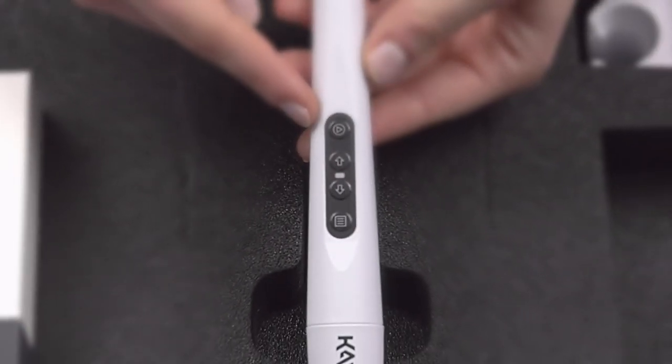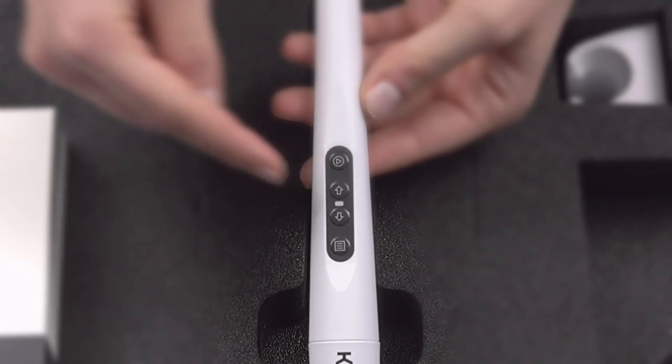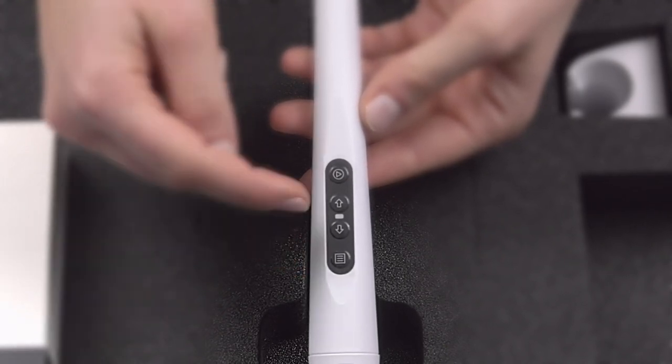This button takes the pictures. You can easily navigate around the tooth diagram using the arrow keys. The menu button allows you to switch easily between the three available recording modes — intraoral, transillumination, and fluorescence.